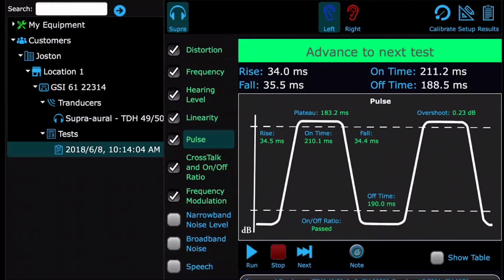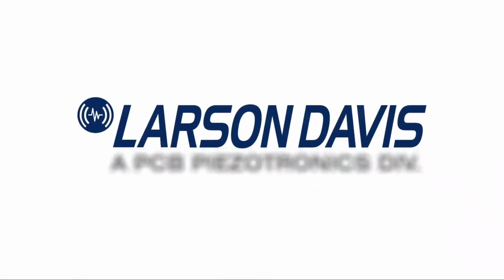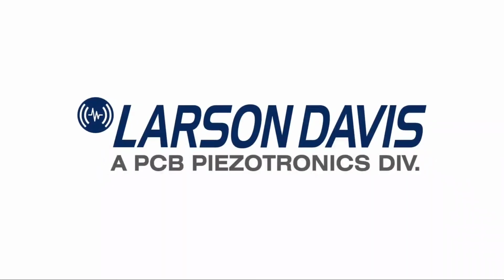To learn more about AudCal and its features, refer to the manual, which can be found on the USB drive or online at larsondavis.com.